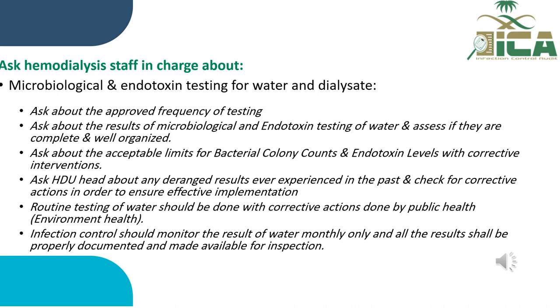Also ask the hemodialysis unit head about any deranged result ever experienced in the past and check the corrective actions in order to ensure effective implementation. Routine testing of water should be done with corrective actions done by public health. Infection control should monitor the results of water monthly, and all the results shall be properly documented and available for inspections.